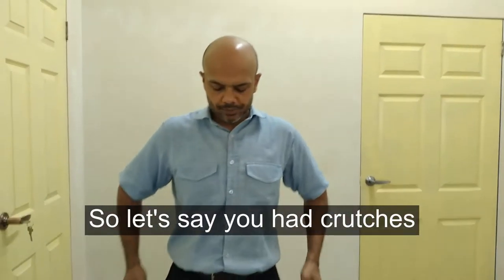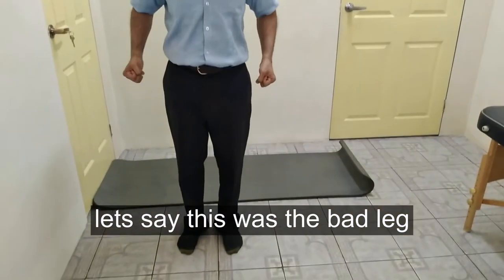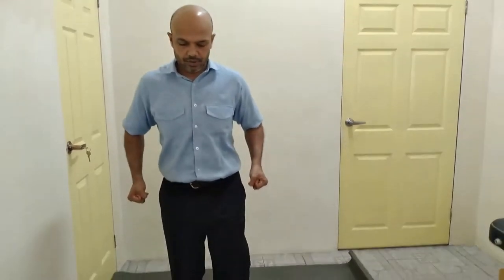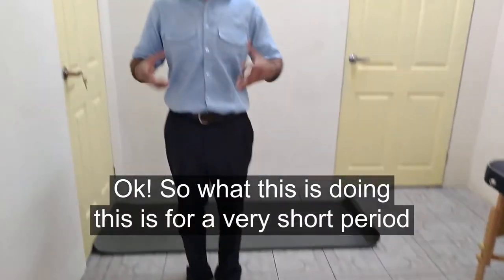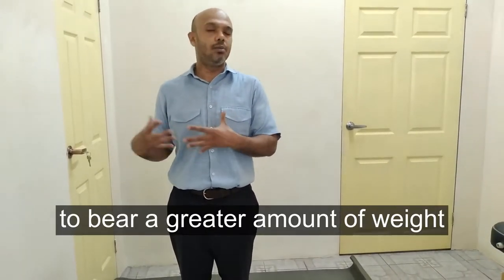Let's say you have crutches. You can hold the crutches here — let's say this was the bad leg. What you can do, just for a second or split second, raise the good leg. This is forcing the weak leg to bear a greater amount of weight for a very short period of time.